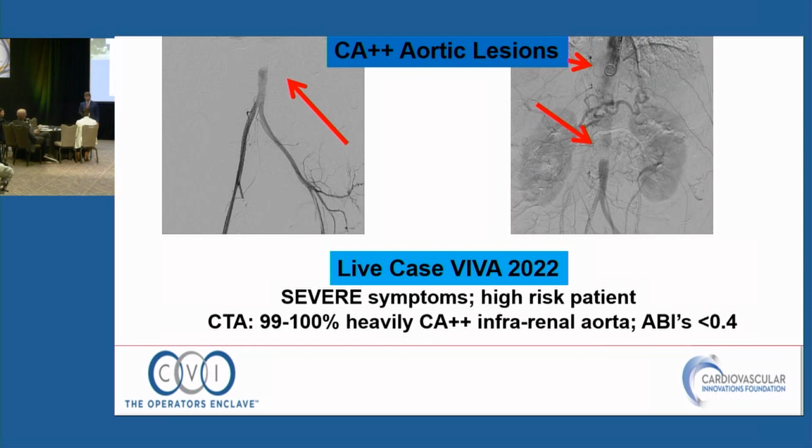Kissing stents in that setting, where you have maybe a 12-millimeter aorta and 6-millimeter common iliacs, you wind up with a lot of material. I could show you several pictures of kissing stents that, personally, I prefer to call them effing stents in this location. There really is a lot of metal at the aortic bifurcation. It looks like a massive bird's nest filter, a lot of metal in a small area, and they don't seem to work very well.